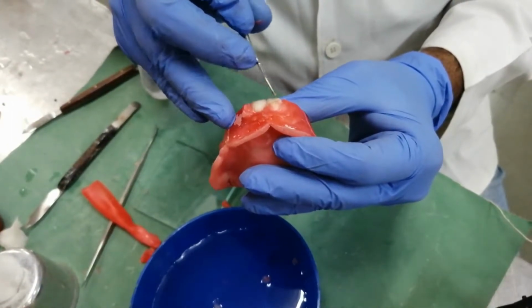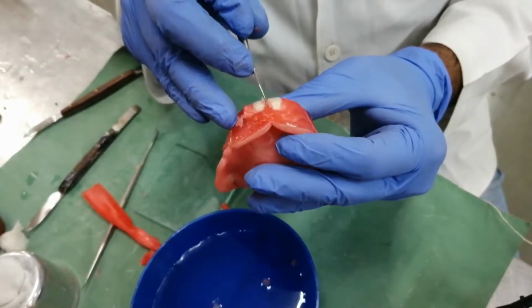Please make sure that facial surface of the teeth is nice and clean.